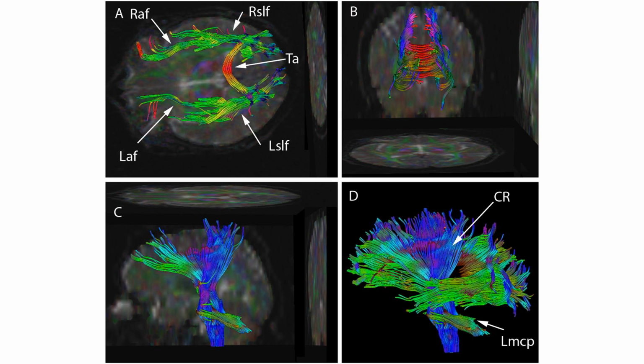The dataset may be rotated continuously into various planes to better appreciate the structure. Color has been assigned based on the dominant direction of the fibers. There is asymmetry in the tractographic fiber volume between the right and left arcuate fasciculus, and between the right and left superior longitudinal fasciculus. Also seen are tapetum, left corona radiata and left middle cerebellar peduncle.